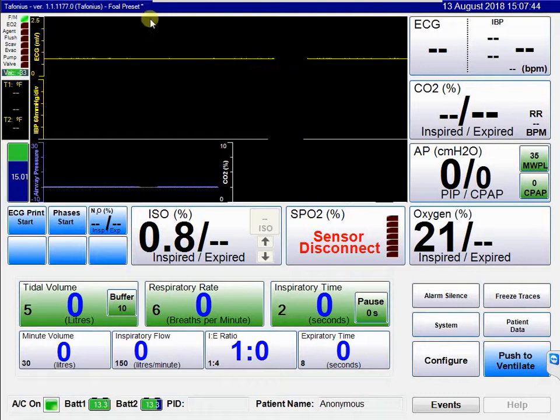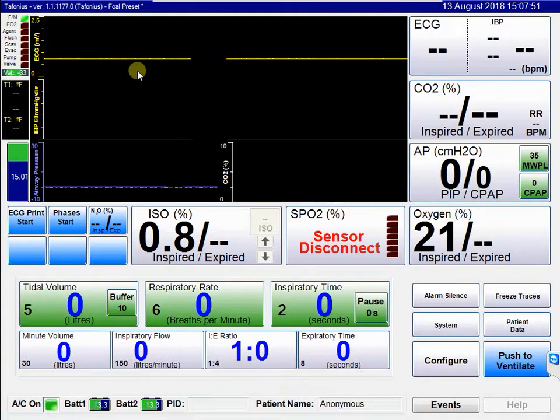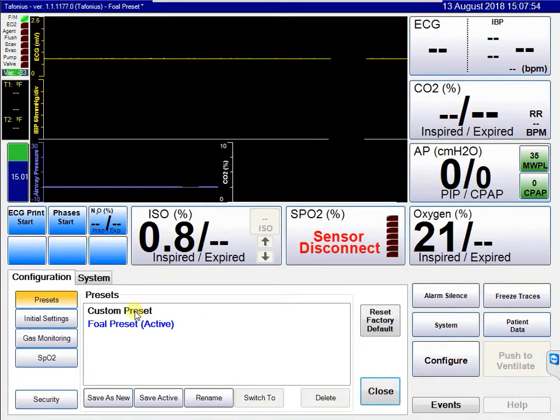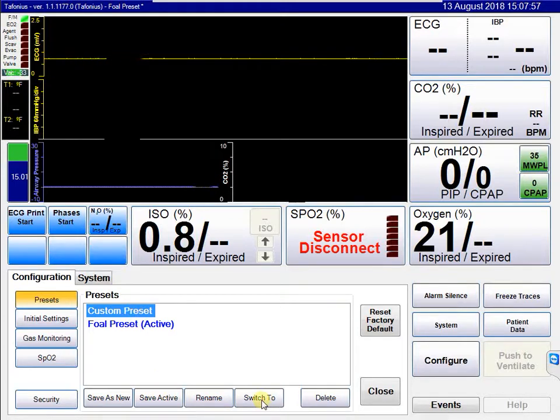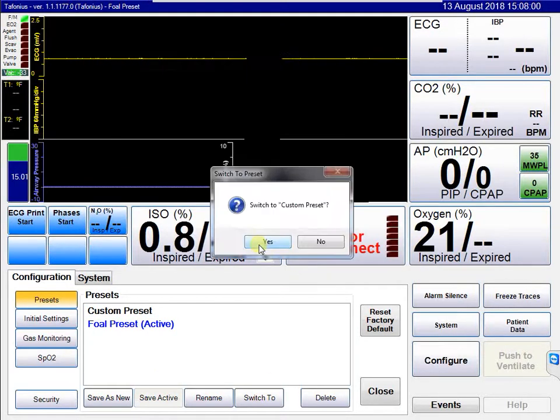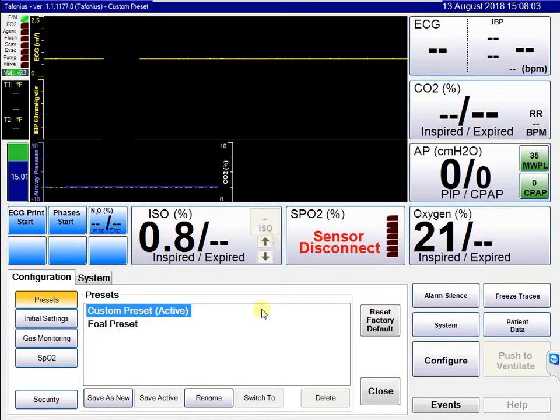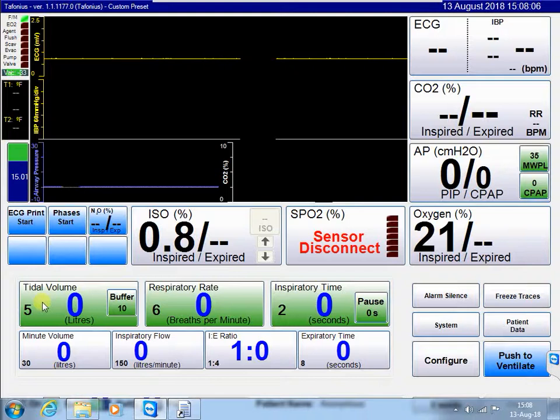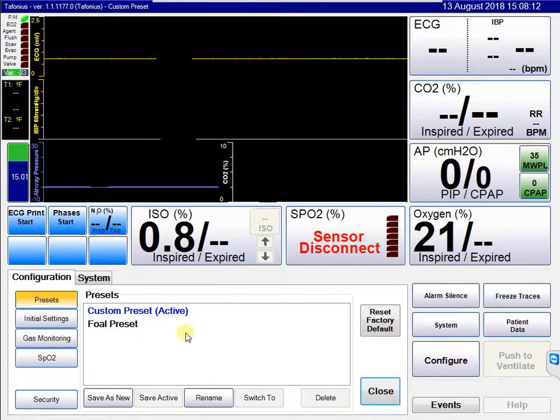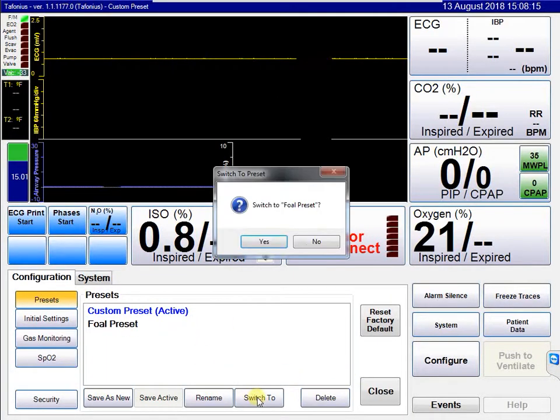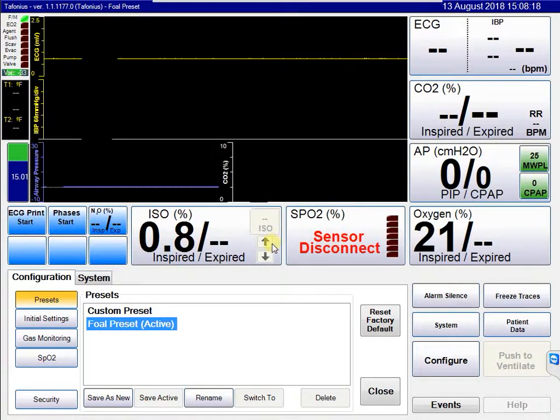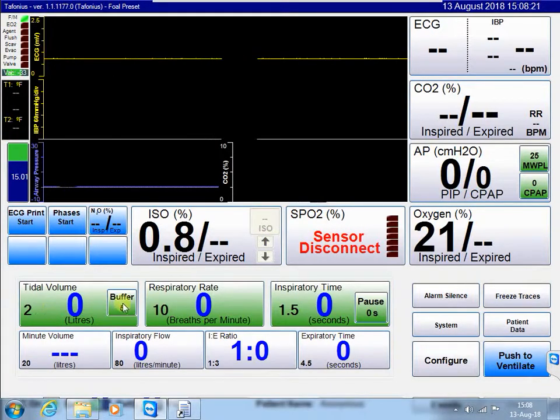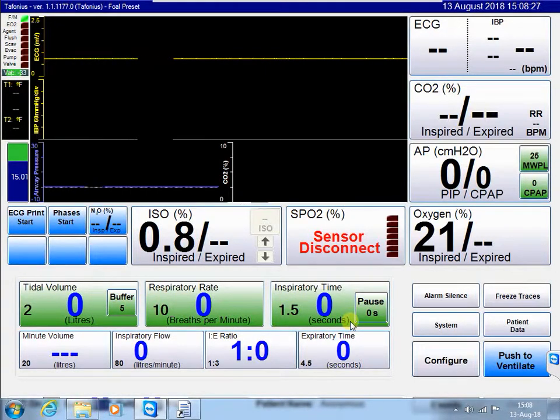After closing, we can see at the top of the screen that we're now running the foal preset. Switching back to the custom preset shows tidal volume of 5, respiratory rate of 6, and inspiratory time of 2. Switching to the foal preset, tidal volume becomes 2, respiratory rate 10, and inspiratory time 1.5, because these are the preset values entered for the initial settings.